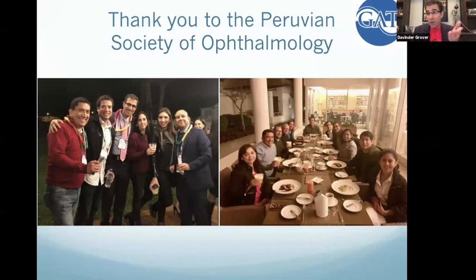Perfect. And like what Juan Carlos was mentioning at the beginning, in those patients where you really think that they are sick and have advanced glaucoma and they need as much as possible, you could consider doing both a GATT and a micropulse. Perfect. But those eyes are soon to be pseudophakic. That eye is going to need a cataract surgery soon anyway.